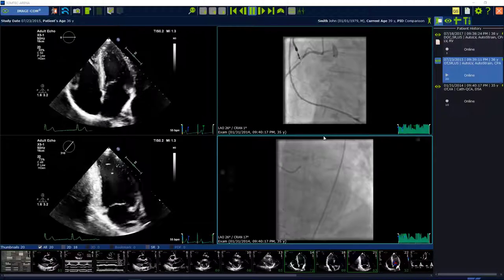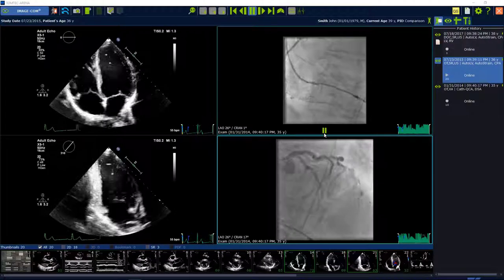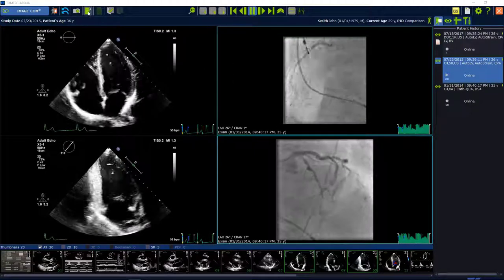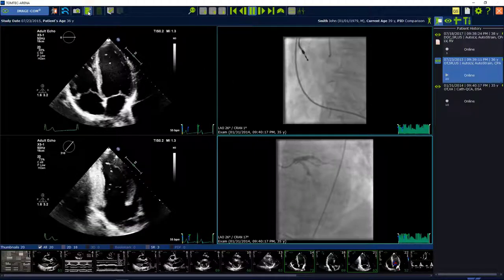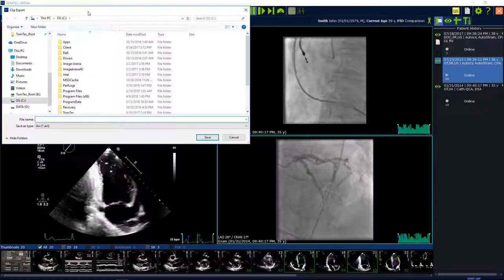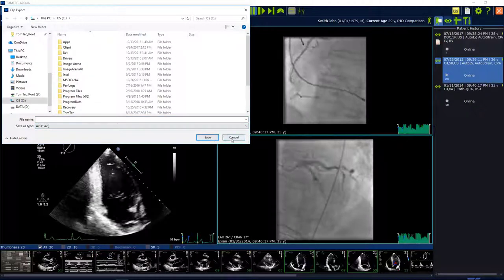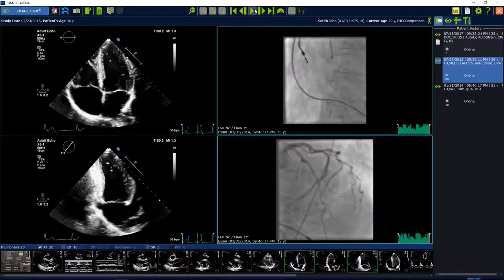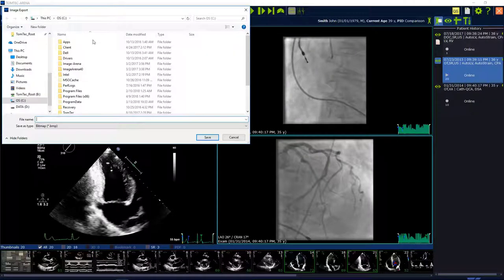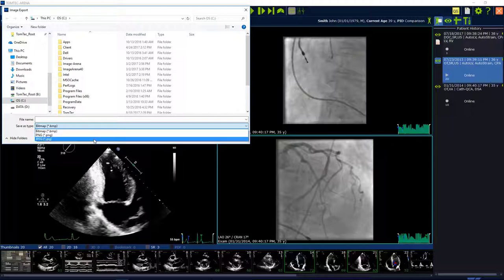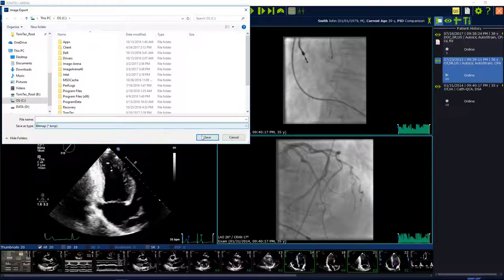Export image or loop: choose the export image or loop button on the top of the toolbar. If the image region is playing, an AVI is going to be exported. If you stop the image region and press the same button — save image or clip — a bitmap, PNG, or JPEG is going to be exported to the desktop, USB, or hard drive.